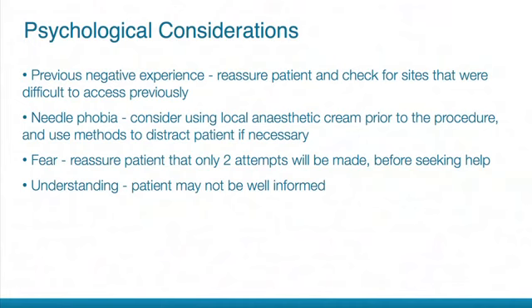The patient may have had a previous negative experience, in which case reassure them and check for any sites that were difficult to access previously. The patient may have a needle phobia, in which case use methods of distraction to remove the focus from the procedure. In the case of fear, reassure the patient that only 2 attempts will be made before seeking help. Finally, some patients may not be well informed, which can lead to anxiety and fear. This can be alleviated by communicating and informing them what the procedure involves and why it is beneficial to them.